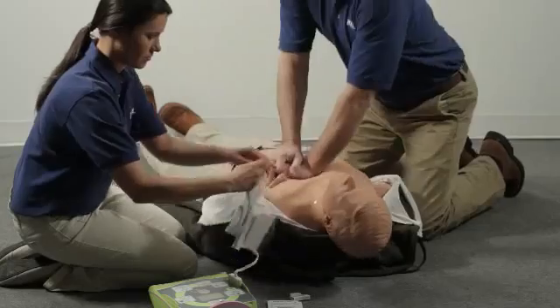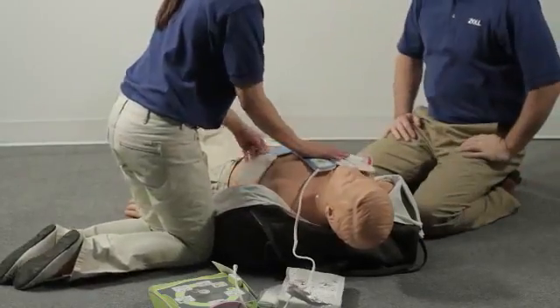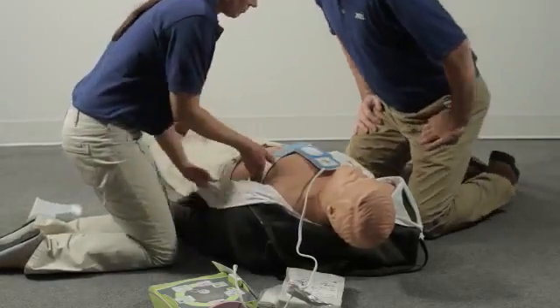Attach defib pads to patient's bare chest. As soon as they are applied, the AED Plus will begin analyzing the heart rhythm. It will not prompt you to do what has already been done prior to attaching the pads.